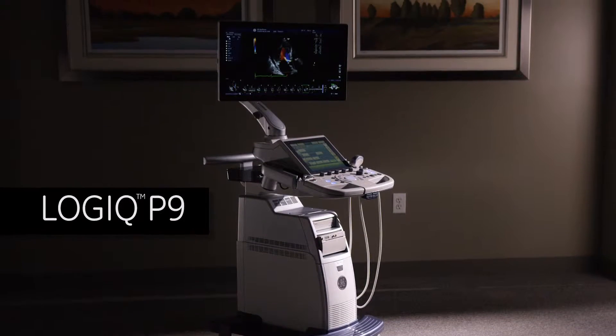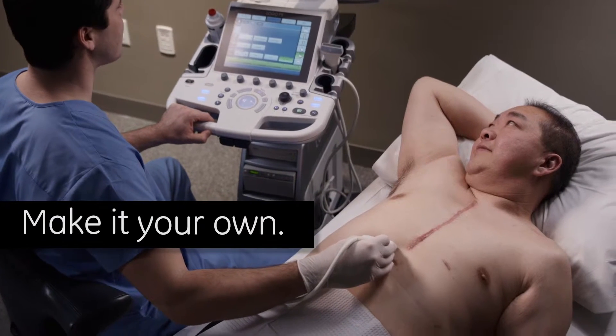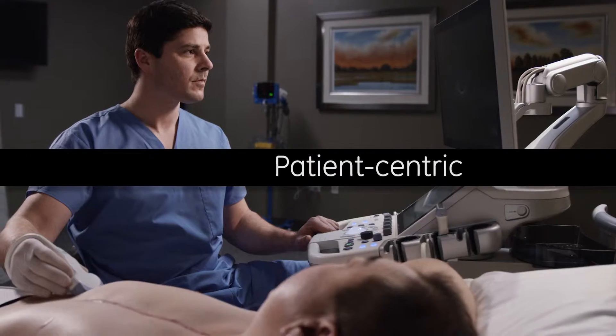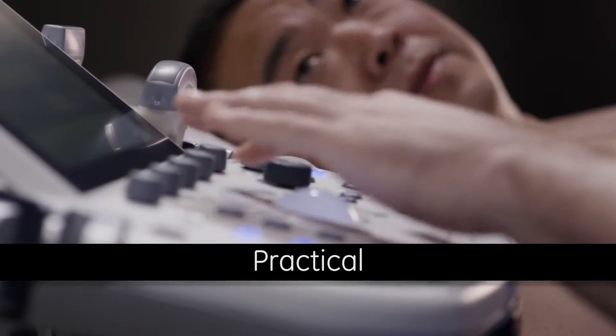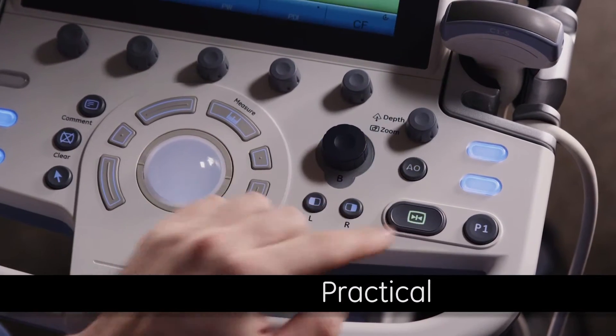The Logic P9 Ultrasound System offers easy operation and enables fast exams. This innovative system allows you to provide personalized, patient-centric, and practical imaging. Designed for user comfort and easy workflow, the Logic P9 is a practical choice.